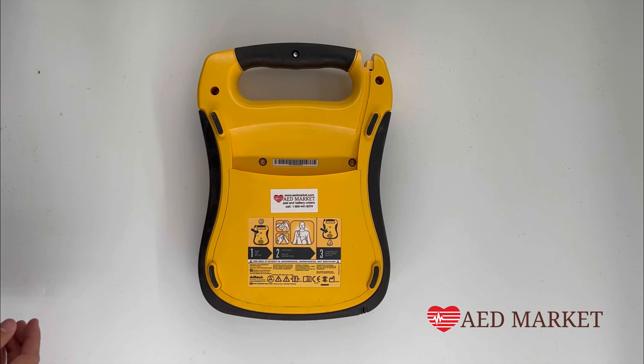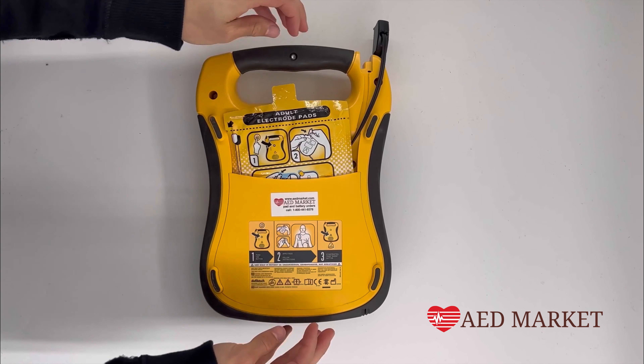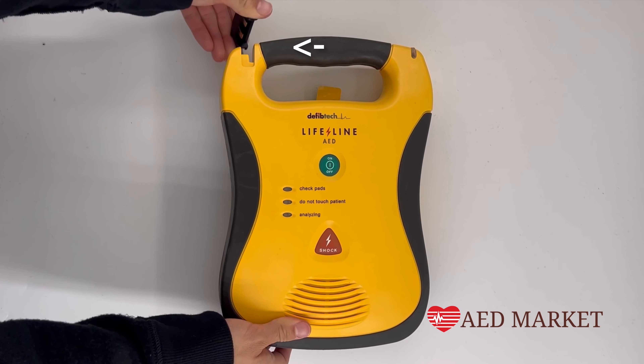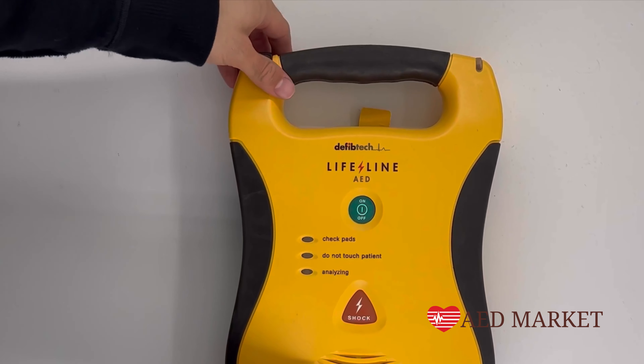Next, insert the new pads, ensuring the wire hangs out from the bottom left-hand side. Avoid tucking them in completely at this point. Then, reconnect the connector to the top and proceed to tuck the wire into the back of the AED.